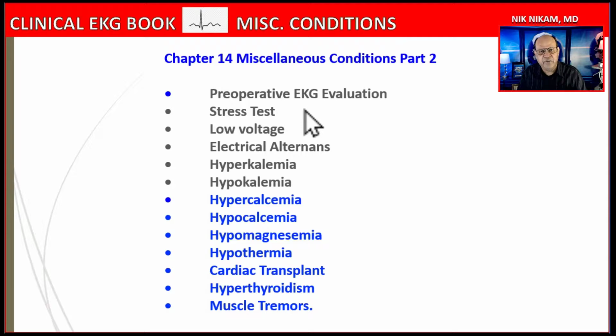One thing I wanted to tell you about stress EKG changes is that the stress EKG changes are most relevant in patients who are on a treadmill exercise test, who reach 85% or greater heart rate, because those EKG changes are not reliable in patients who go through dobutamine stress test or regadenoson stress test, or even a bicycle exercise test, because they have to be able to reach the target heart rate, the target MET levels, in order for the changes to be significant.